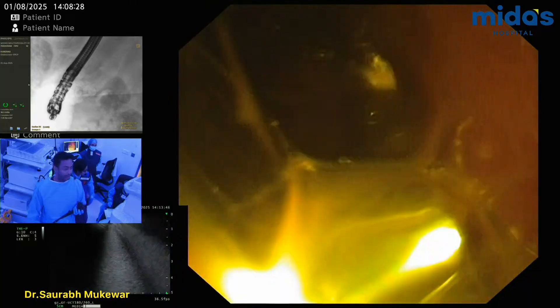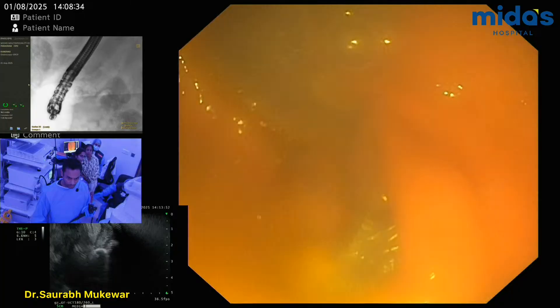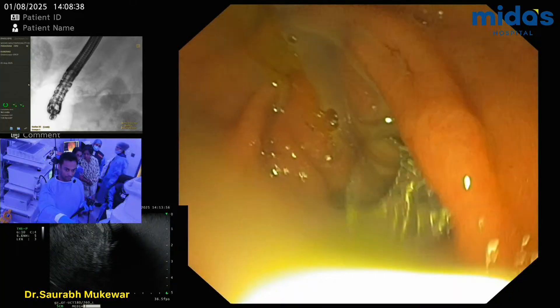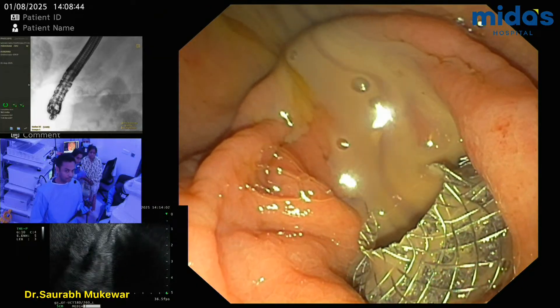Look at this. Come here. From here he's seeing the stent — it's metal. Look at this. See? All the pus is coming. Now it's coming — everything will get out.